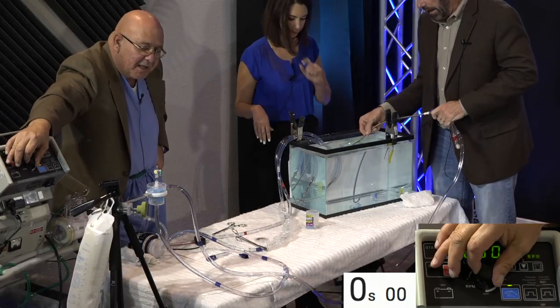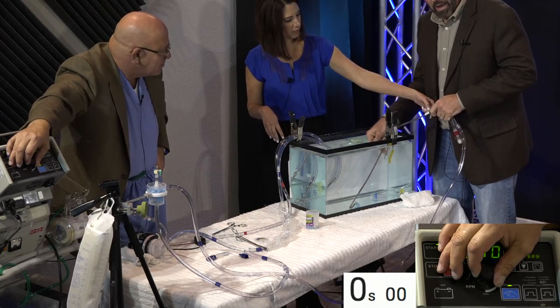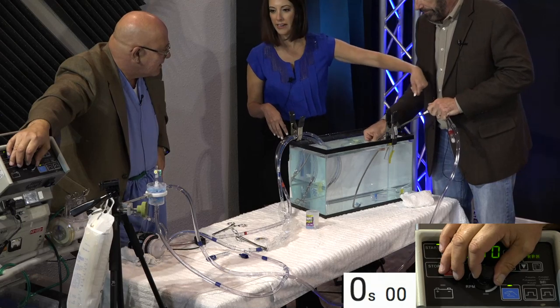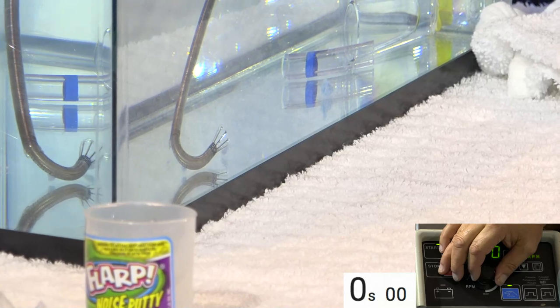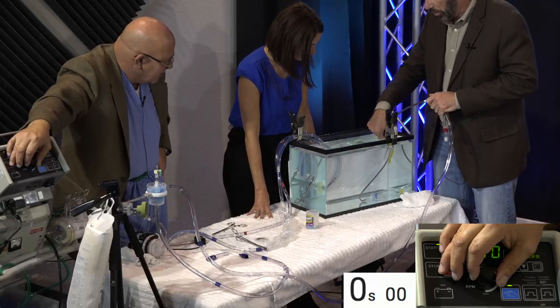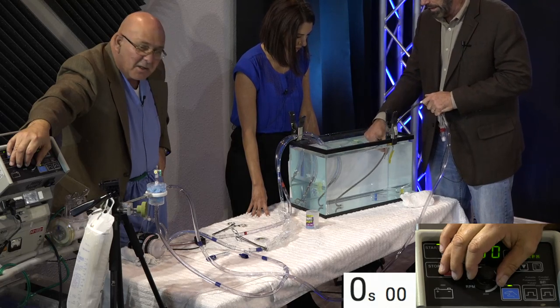Our filter is occluded. We're sucking air all over the place. A lot of that is because we're not primed within this. Yes, we keep pulling the air coming out of the back of this. But you can see now that we're flowing again, and we had a secondary IVC filter in that I can go through, and this stuff is all being caught in the filter. There you go. And then we're able to go through and clean up all the rest of that material.